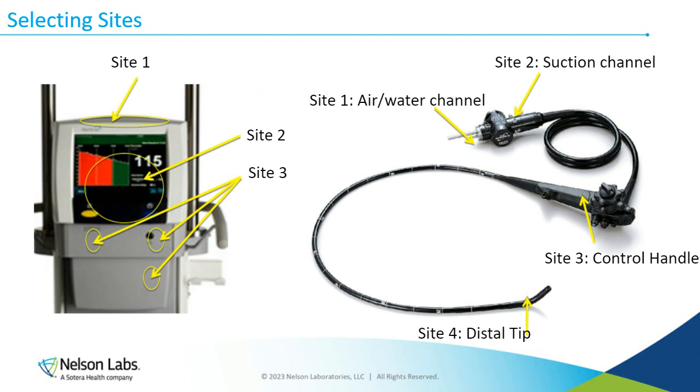Selecting sites is a big issue because we want to make sure that we are challenging the sites that will be contaminated during use, right? A lot of times we see a lot of disagreement saying, no, this will not get soiled, let's just not worry about this. But we usually would recommend the areas that we often see, and we see thousands of different tested devices that flow through the lab for validation testing.